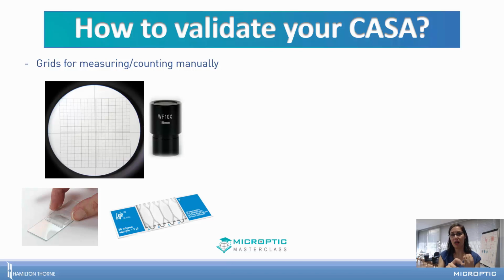That could be different aliquots, the use of non-proper pipettes. For instance, it's very common to use conventional pipettes for loading chambers instead of the positive displacement pipettes that are recommended for handling semen samples. Here you can introduce a variation during pipetting. Also, depending on the width of the field to be analyzed on the microscope, you can introduce some sources of variation that at the end will be in charge of a high variation between manual and automatic results. Okay, so we should control all these variables as much as possible.